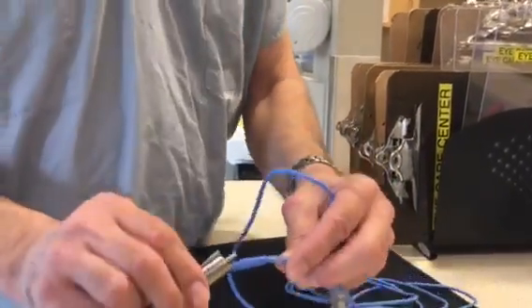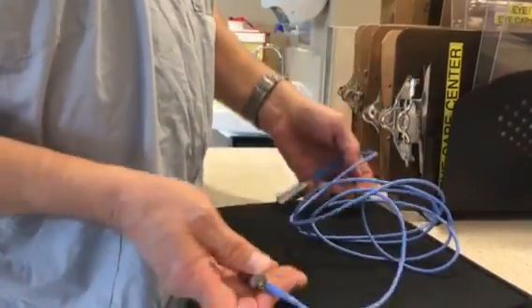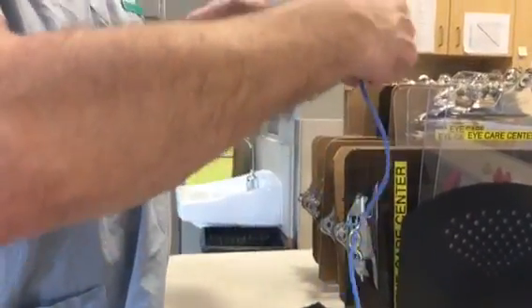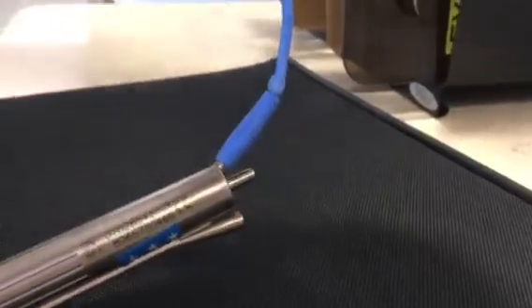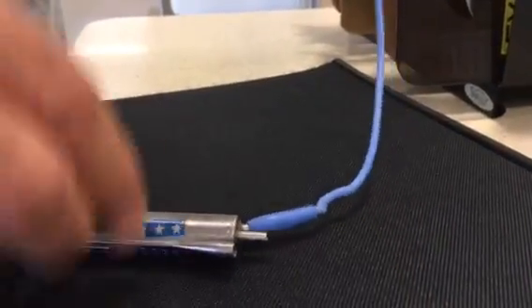Okay, so what we're going to try to do is get this little hernia that's developing at the instrument end out by milking it down and away from the other side. So as I'm going here, if you watch down there, as I'm getting closer, you should see it begin to come out. There, it's already out a little bit.